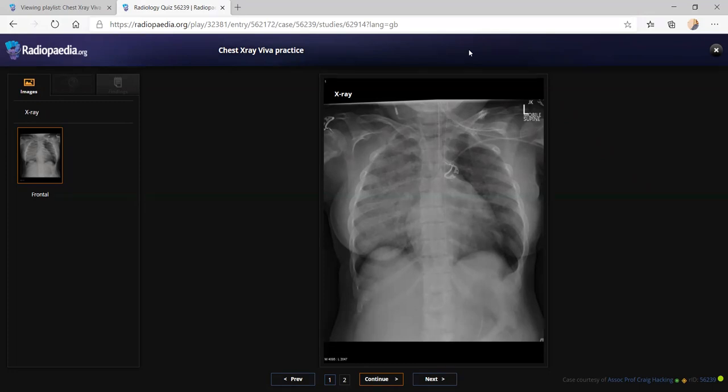Okay. So going by the ribs, I'm thinking of the possibility of a developmental condition. Do you mean this line? No, I didn't mean that line actually. I meant, I think that this is the line? No, the one that is just left in the subclavian.